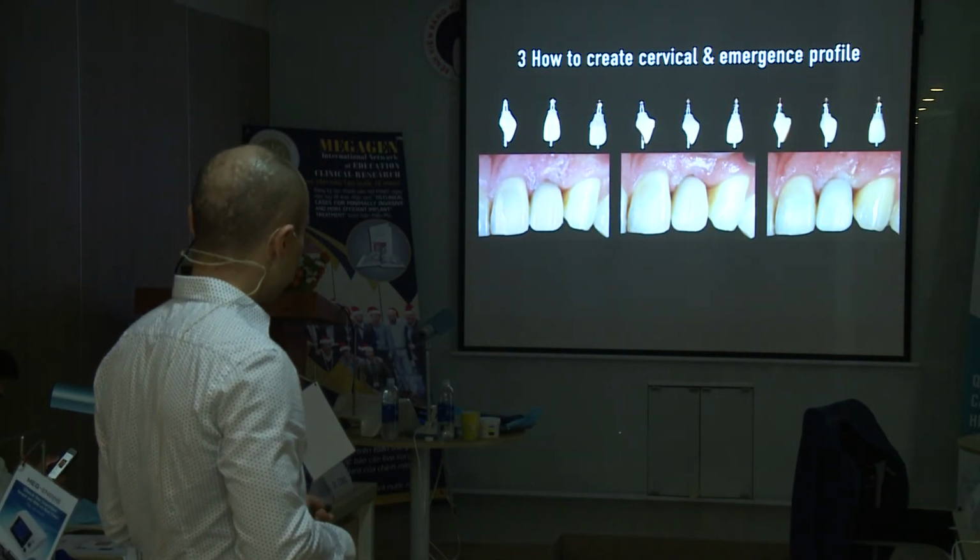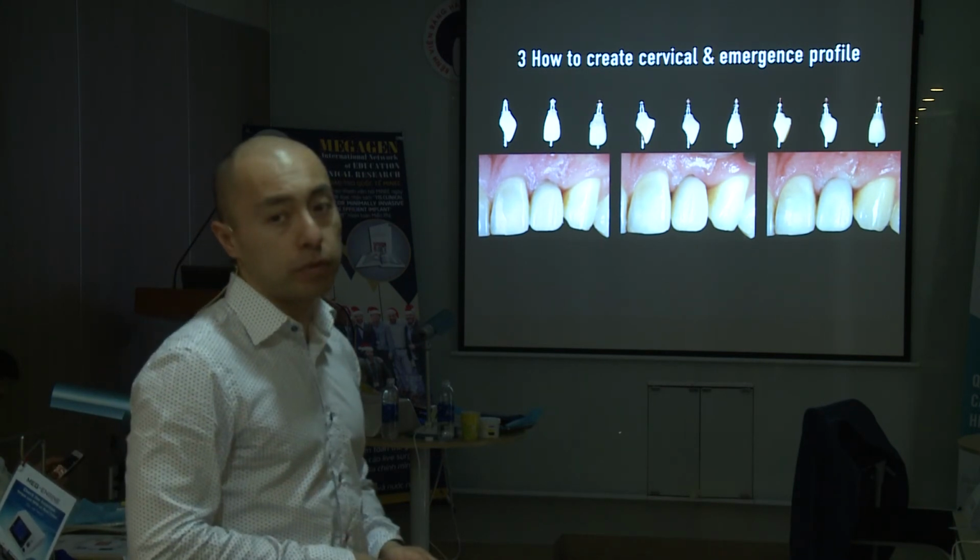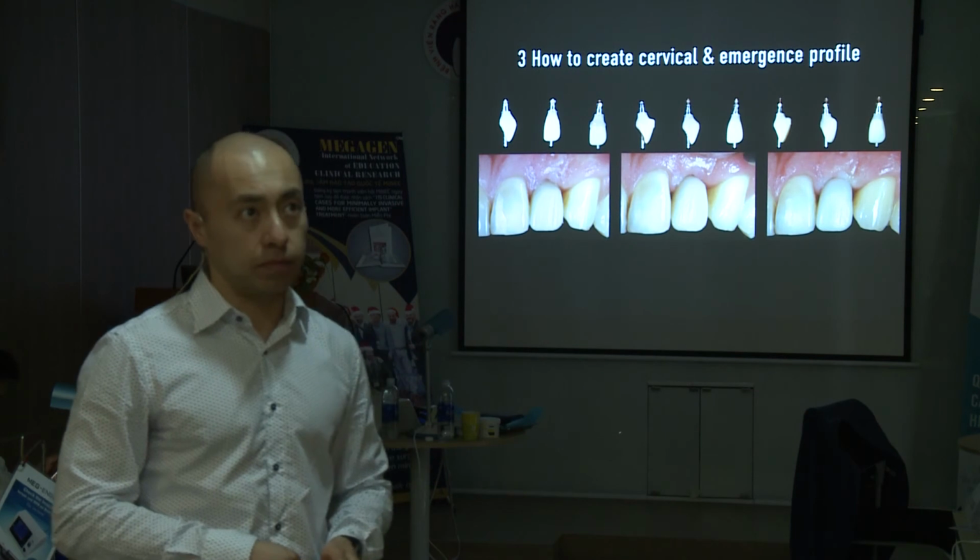And the third one is the temporary crowns. And this is absolutely necessary in the aesthetic zone.